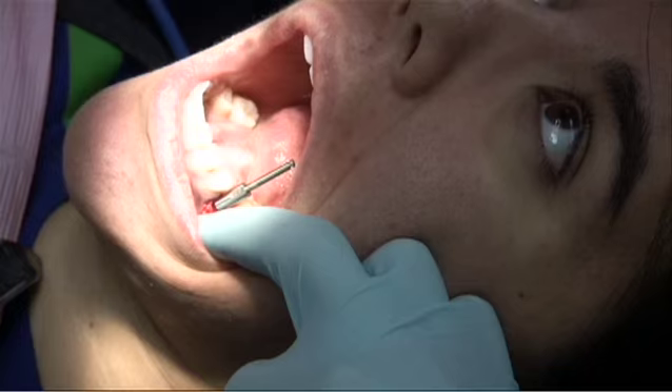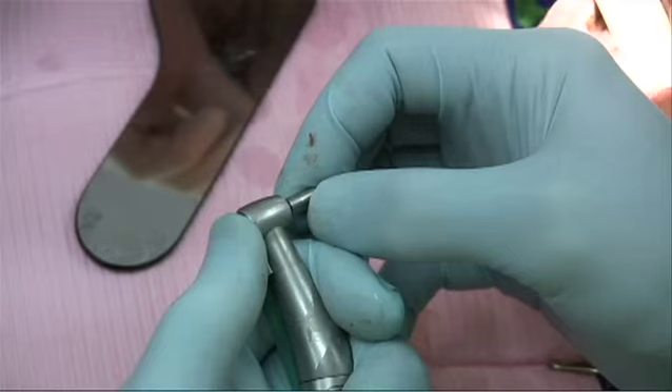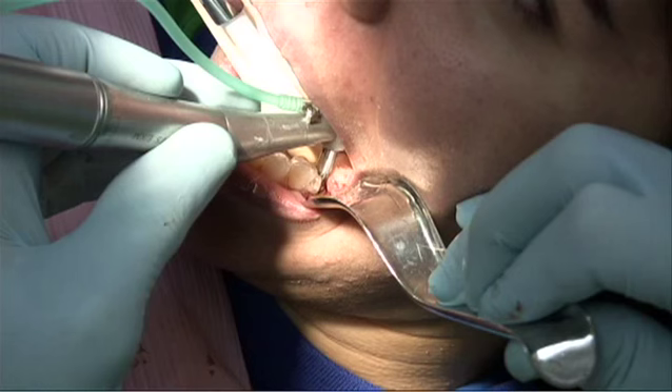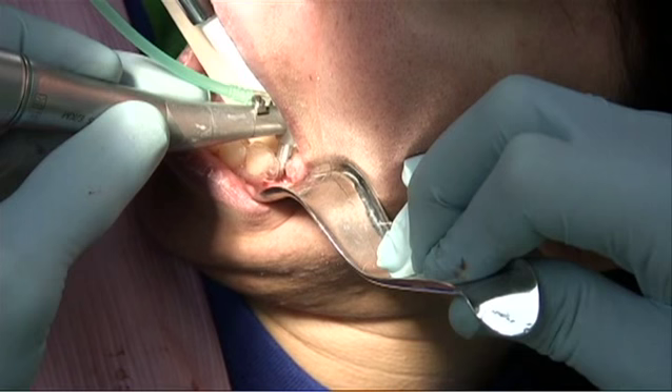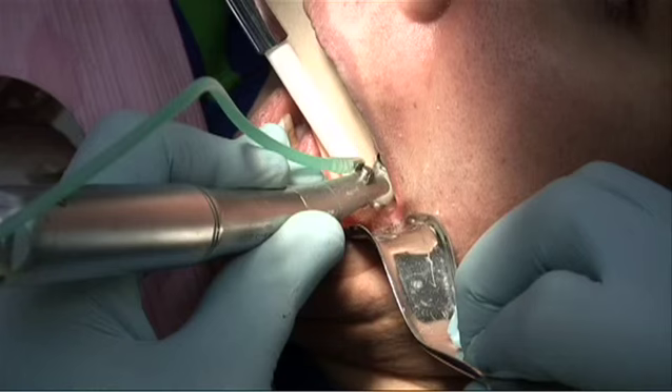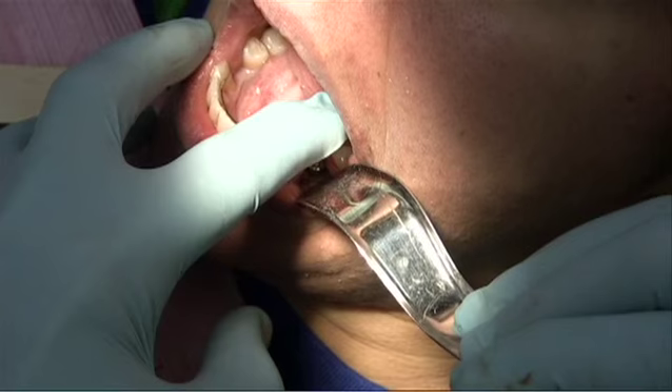After the pilot drill, an x-ray may be taken for axis evaluation. As you can see, the guide controls the axis perfectly. Proceed with the 2.2 drill — the drill stop is preset to the 10 millimeter mark. You do not have to strain to see the markings on the drill. The drill stop will limit the depth when it reaches the bone while the guide controls the axis. The guide is removed and the depth gauge, which is set to 10 millimeters, is placed to verify your depth and platform position.